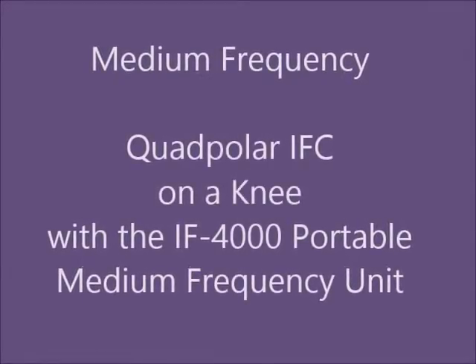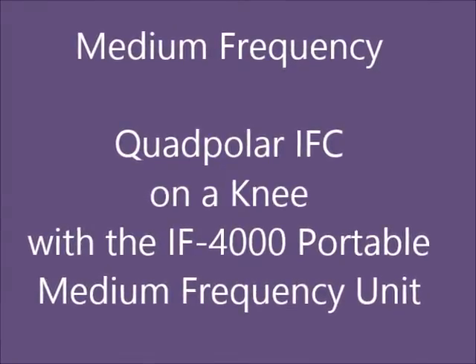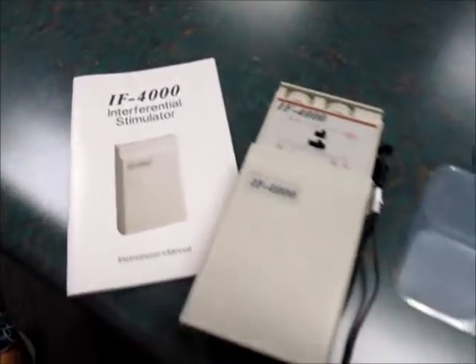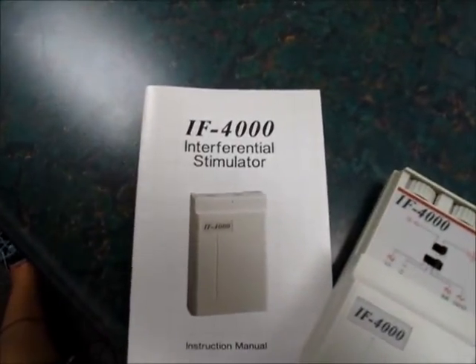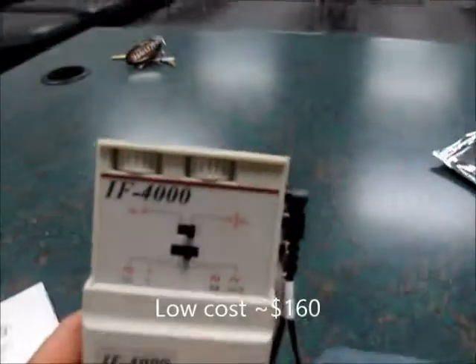This is a demonstration about using quad polar interferential on a knee with the IF4000 Interferential Stimulator. This is the little unit, and it's roughly $150 to $160.